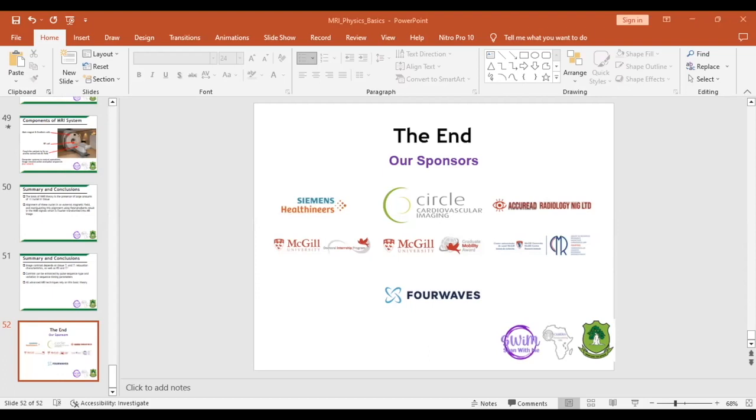You get wrong information, and I used to make that mistake before. Before you select the darkest myocardium, you should check whether there are artifacts that might mimic the darkest myocardium, because you have to scroll through your TI Scout and be very sure that there is no artifact mimicking the darkest myocardium during your scan.